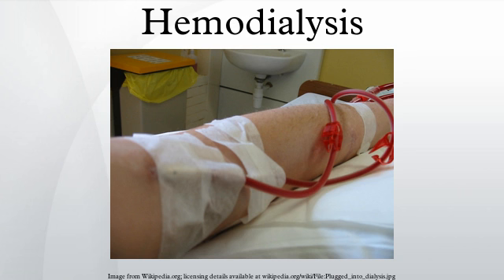Because the damaged kidneys cannot perform their intended function of removing impurities, ions introduced into the bloodstream via water can build up to hazardous levels, causing numerous symptoms or death. Aluminum, chlorine, fluoride, copper, and zinc, as well as bacterial fragments and endotoxins, have all caused problems in this regard. For this reason, water used in hemodialysis is carefully purified before use.